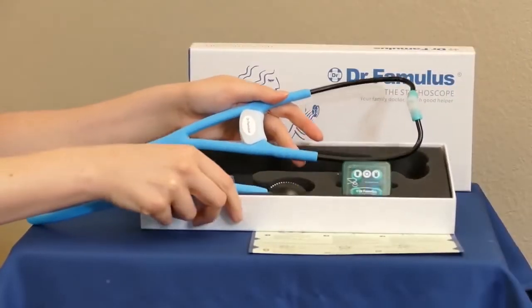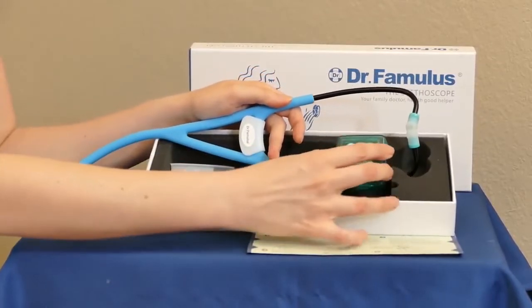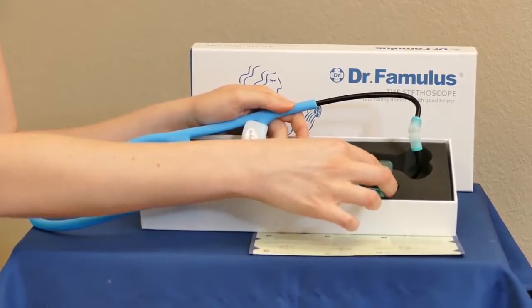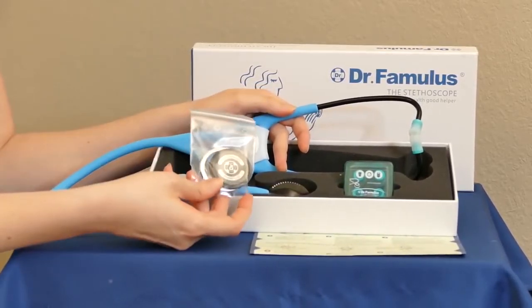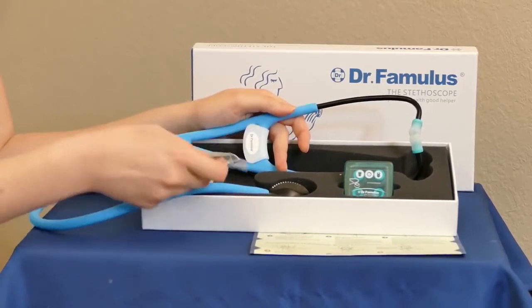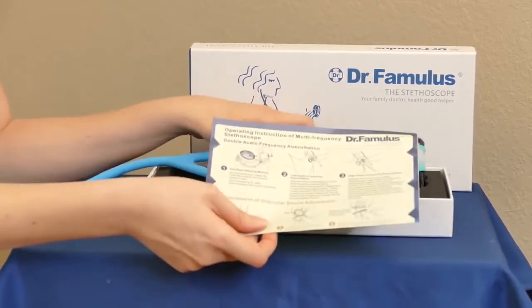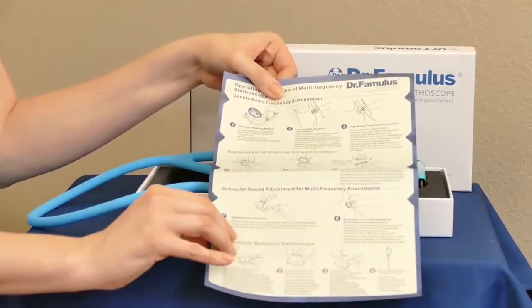Right off the bat, opening up the stethoscope, you can see that it comes with a couple of additional earbud pieces in different sizes, which is really nice. There are also some replacement pieces for the stethoscope as well, and a little instruction booklet that talks about how to use it, how to clean it, and how to replace the pieces.